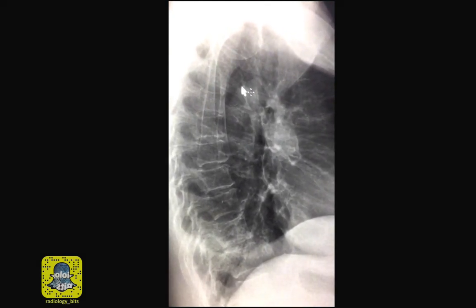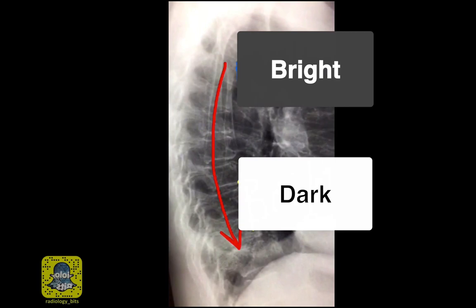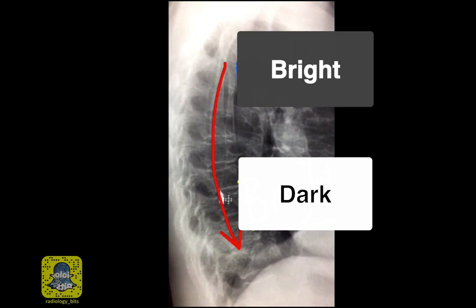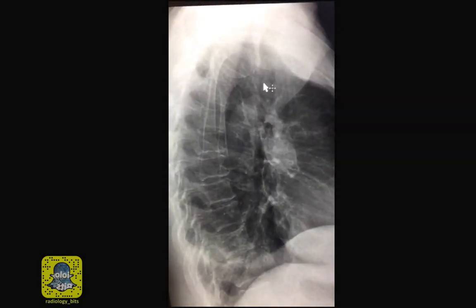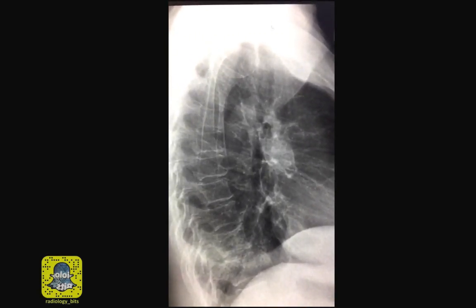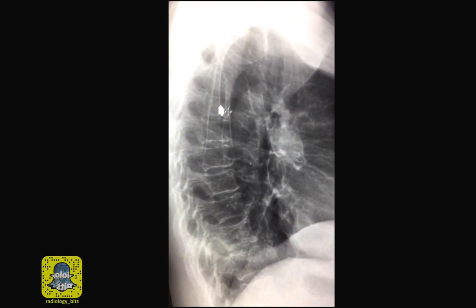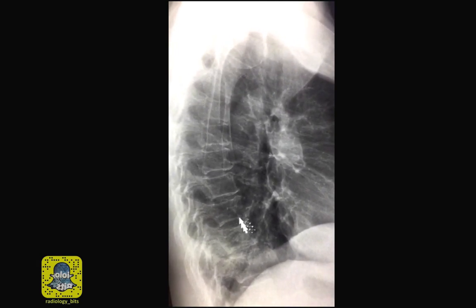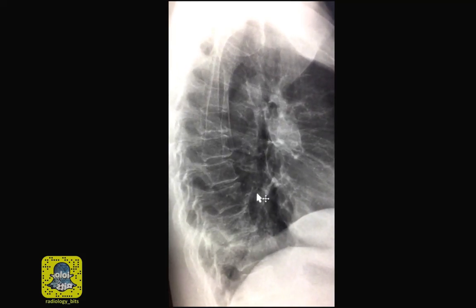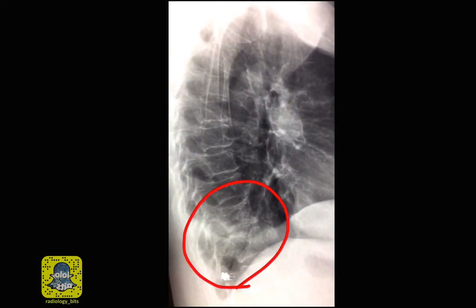The rule is: if you look over the posterior chest over the spine, the density should decrease as you go from above to below. So you're going to have increased darkness as you go in this direction. This is because you see more white structures in the upper lungs from the projection of the soft tissues of the shoulders. If you don't have increased darkness as you go from above to below over the spine, this tells you that there's something wrong in the lower lungs — something abnormal in one of the lower lobes on the right or on the left.